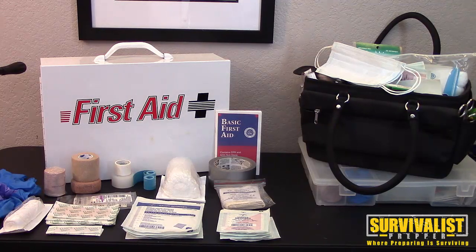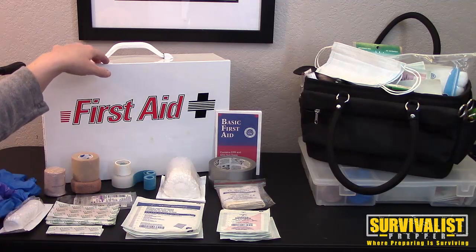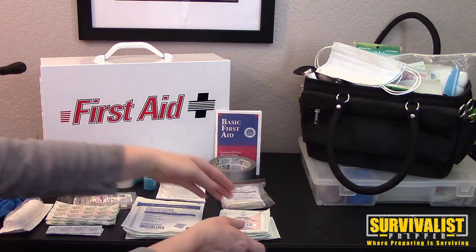In this video we're going to explain some of the bandages, dressings, and supplies for dressing a wound. Lisa is going to explain what some of this stuff is — a lot of it is self-explanatory, but let's just go over everything. To start off, you need a first aid kit, and here are the different types of dressings you can use.